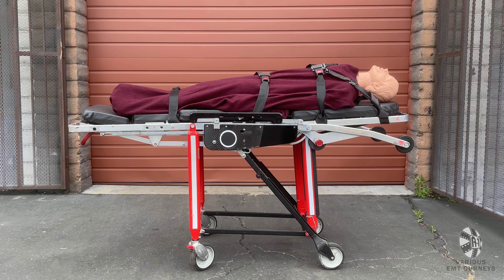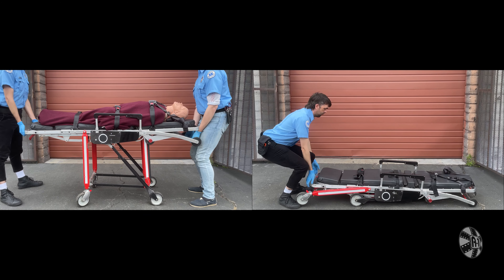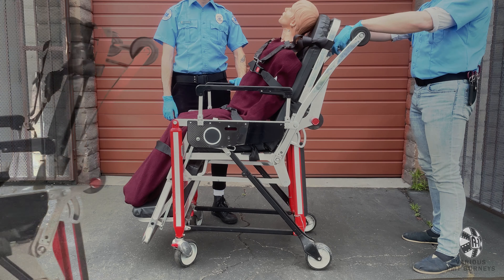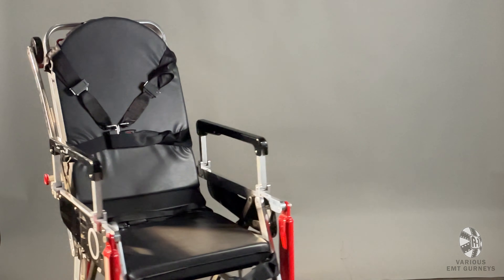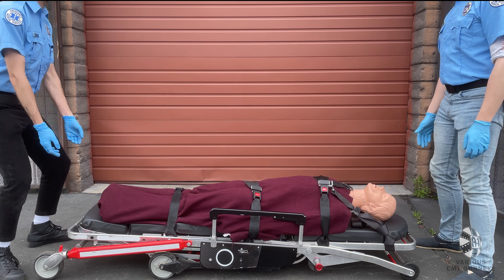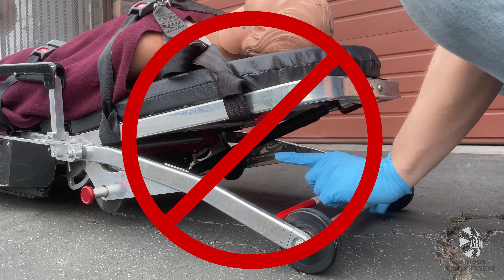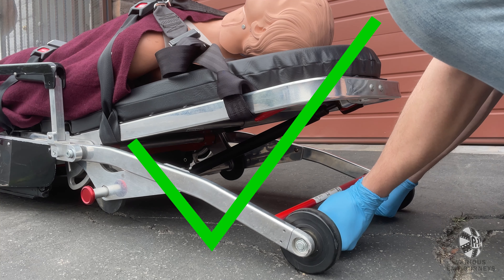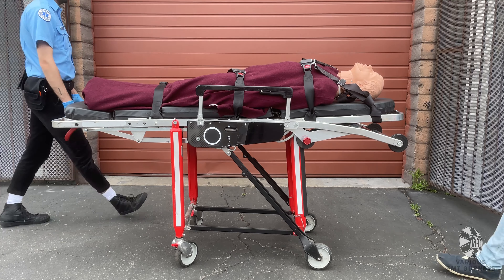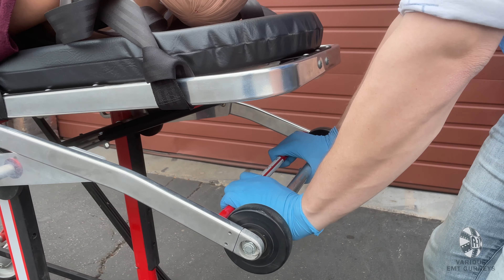The Ferno EMT chair cot is unlike our other gurneys, because besides being able to raise and lower, it also has the ability to transform into a chair at the pull of a trigger. To raise the gurney, you will need two people, one at either end. Grab the frame using an underhand grip, being sure not to grab the backrest or conversion handle. Grab the frame and lift up until the undercarriage locks into place. Once in the raised position, the Ferno chair cot can transform into a chair by squeezing the conversion handle, pushing down slightly, and then pulling up.